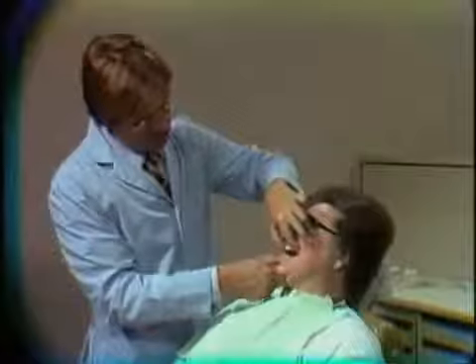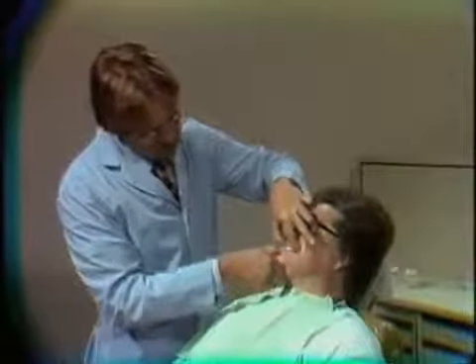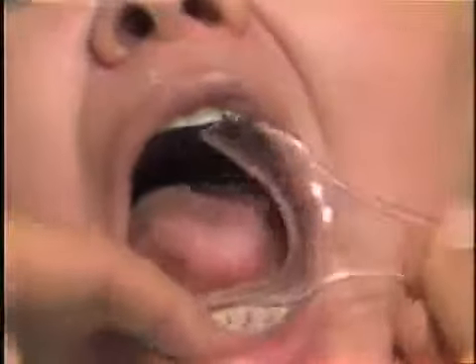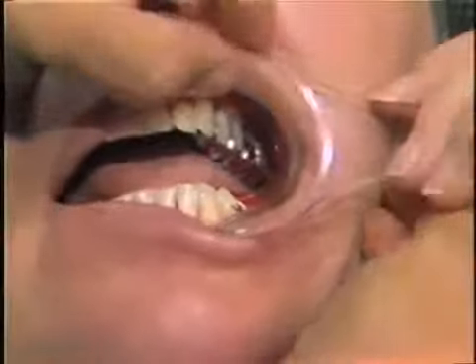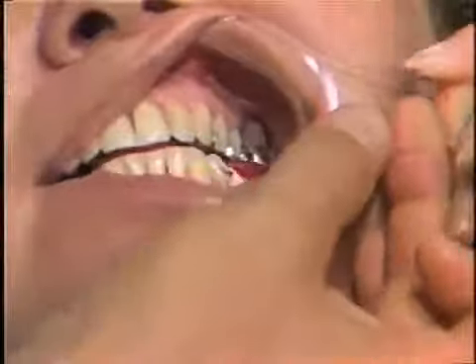Okay, just close down into that. Very good. I'm going to have you open. Now let's seat this in position. Okay, now that's right. If you could hold that. Very good. Hold it up and out. Very good. Now bite down.